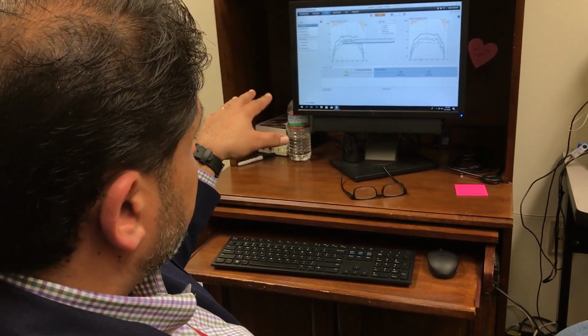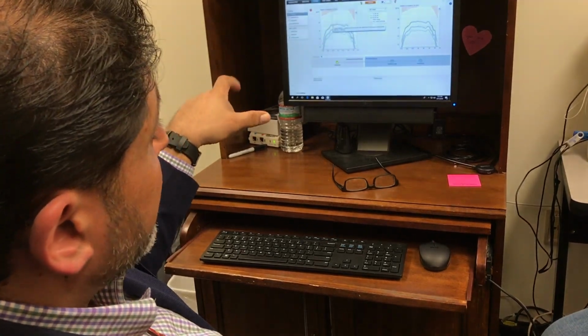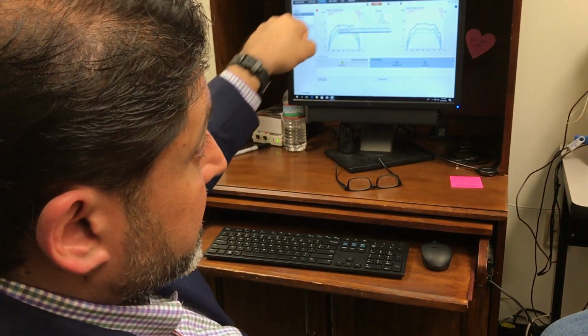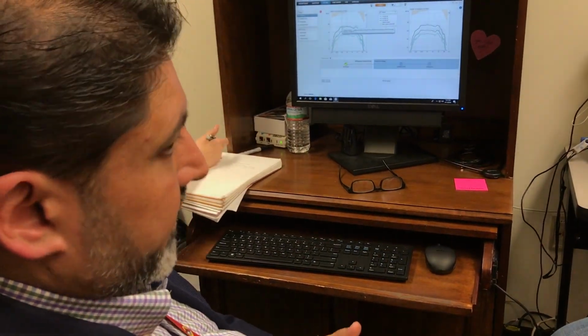Well, so think about it. You're right. We have those short-term fluctuations, but if we just do the long-term average speech spectrum or the RMS, we get that one curve, right? So why are we doing 3 of them?